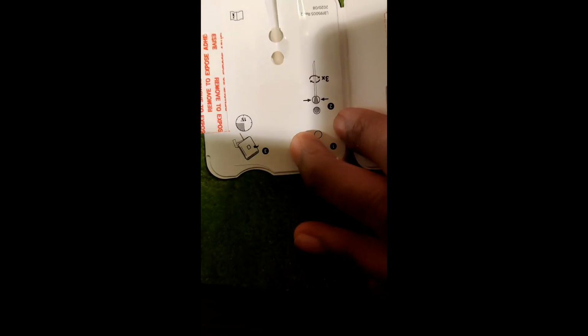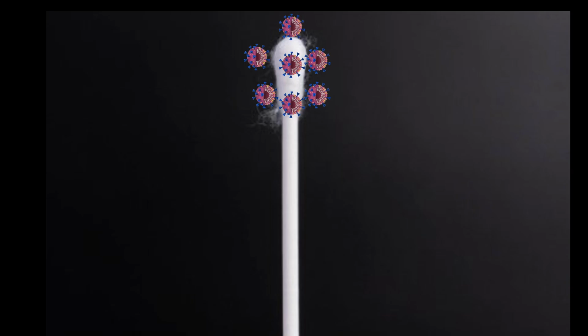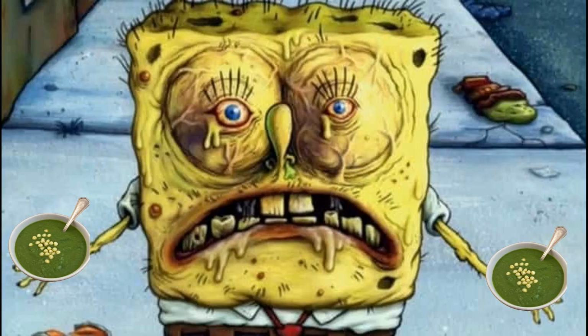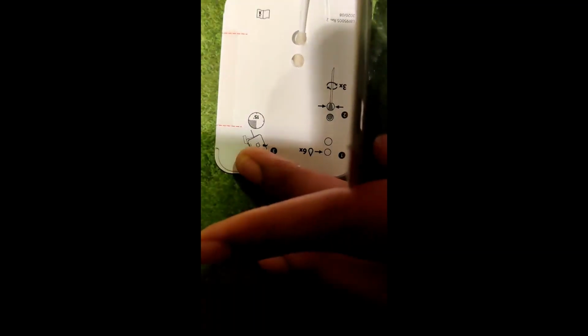After the squirting takes place in the well, you have to insert the swab into the well and rotate it for several seconds. The extraction reagent allows you to go from having full virus particles on the head of the swab to broken down parts of the virus in the liquid like one big soup. Still beats pea soup any day of the week because that stuff is just nasty. Damn! Bruh. Then you gotta close the card, let the virus sample make contact with the test window, and let that test cook for 15 minutes.